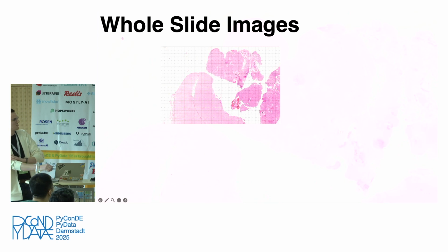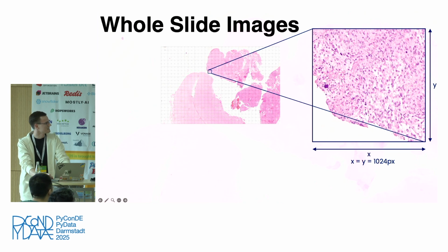As talked about, why can we still steal from radiology? We simply separate our large image into tiny parts, and these tiny parts are no larger than in radiology, so we simply throw all the algorithms radiologists use on our images. It's quite nice if you reach this goal. Taking a look at it, it also looks quite more comprehensible in this way.